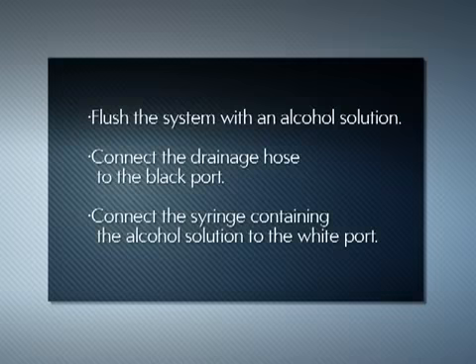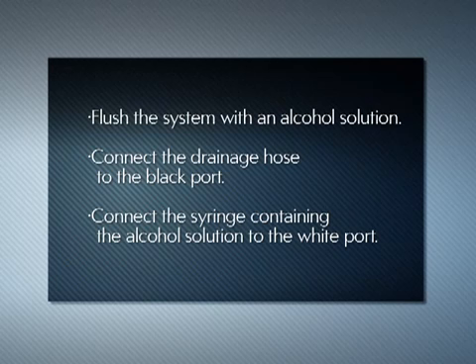When a session is complete, we recommend that you flush the system with an alcohol solution, making sure to connect the drainage hose to the black port and the syringe containing the alcohol solution to the white port during the flushing procedure.